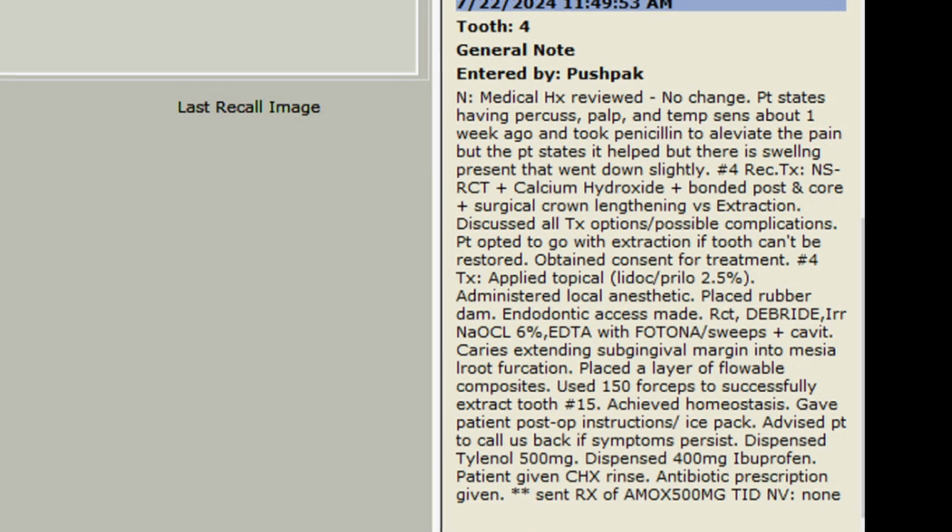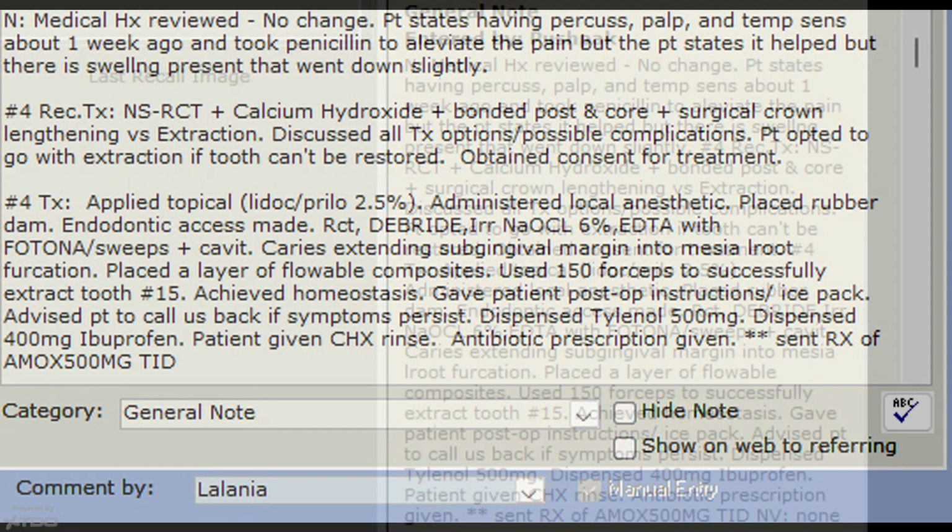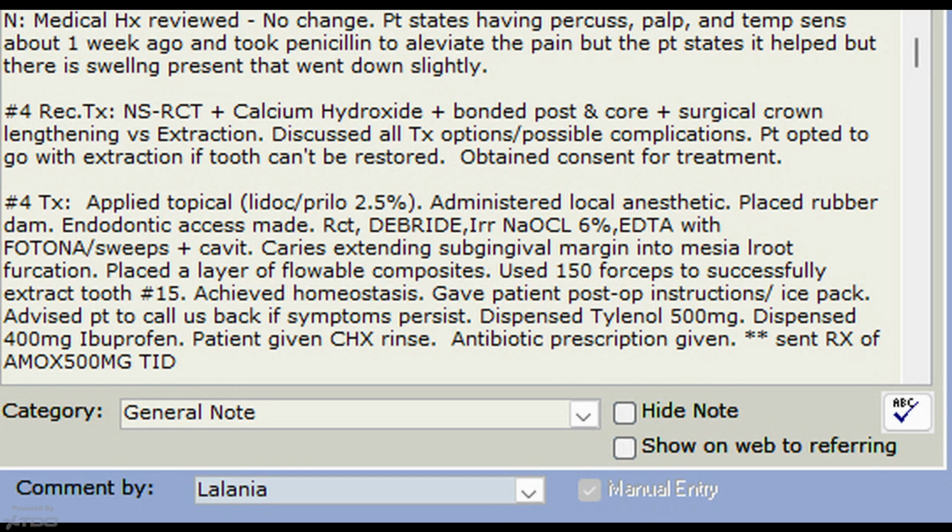After initial cleanup, the tooth was temporarily isolated to contain the endodontic irrigants and facilitate an advanced irrigation protocol using the Fotona laser for activation. After endodontic disinfection, the canals were sealed with Cavit prior to final caries control. Caries appeared to extend into the furcation and mesial furcal invagination. At this point, after further discussing the prognosis, patient opted to continue with the extraction.